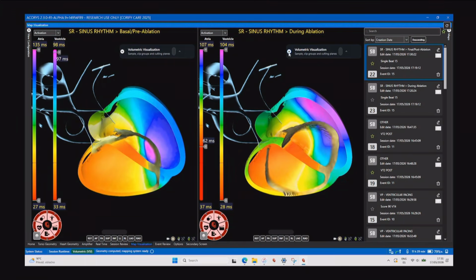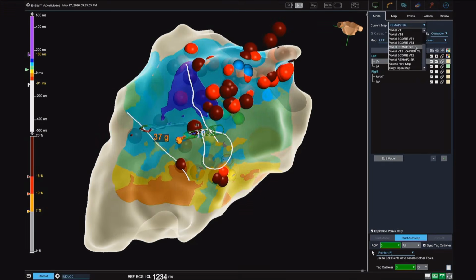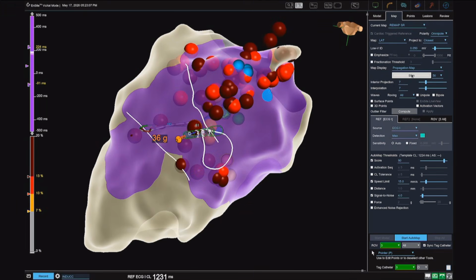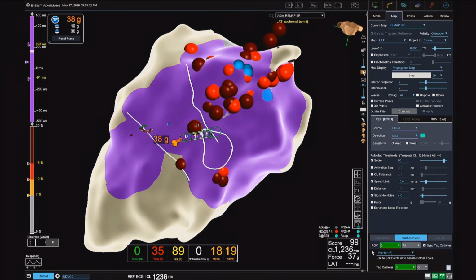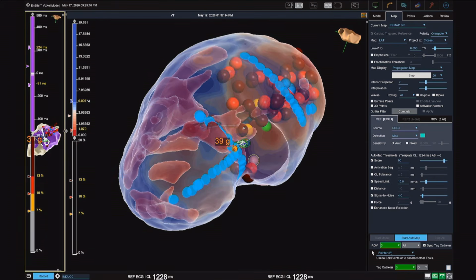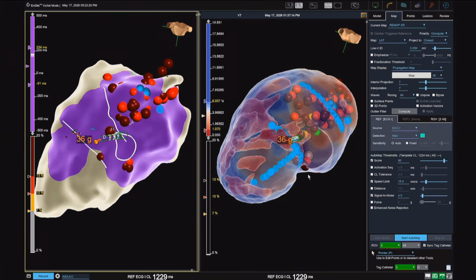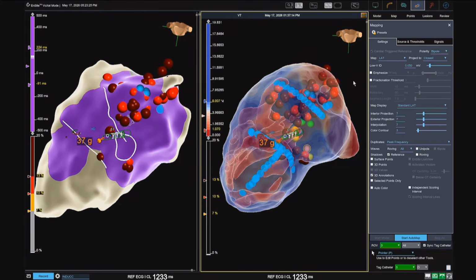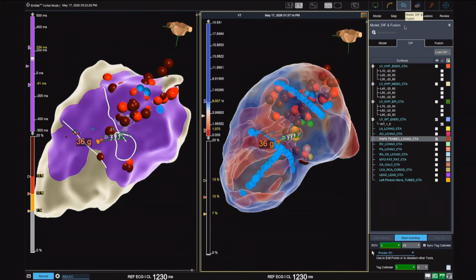And it has been nice that, can you propagate the first remap, please? The first remap, yeah. So it's nice if you propagate the maps to understand what's going on. If you propagate it, please, see that there is conduction from both parts of the channels. Put the CT side by side. Okay, so if you see in this transversal channel close to the papillary, there is conduction from both lateral and septal sides. So you have to close either in the middle or on both sides.